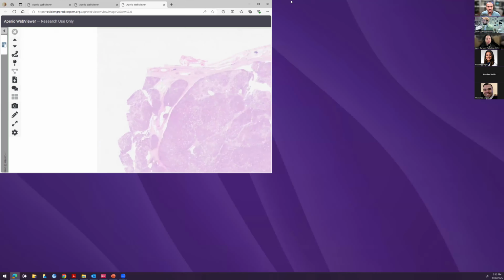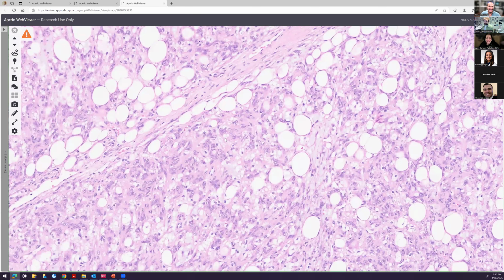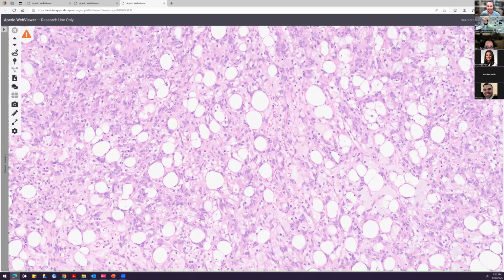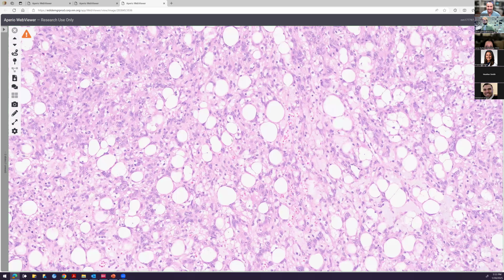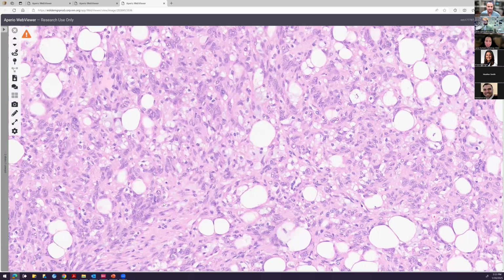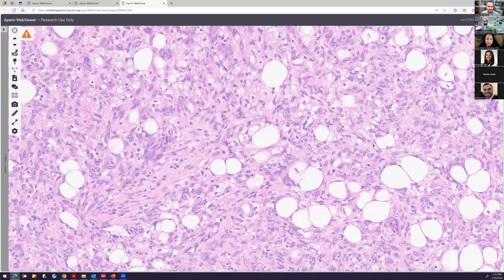Let's go. Here's one. There you go. This is the problem. Oh, look at this. It's probably some sort of adipocytic type tumor. Yeah, look, there's a lipoblast there. Oh, no, this is a lipomatous SFT. So this is a big problem. Just look at the background cytology in the cells, and you see this more plump, hemangiopericytoma-like background, and there's collagen.